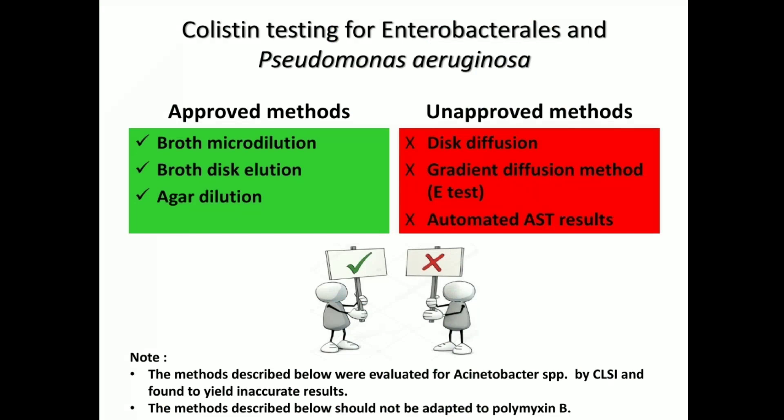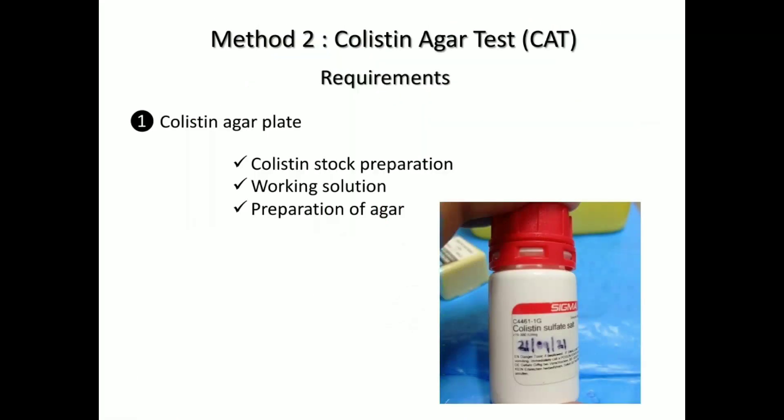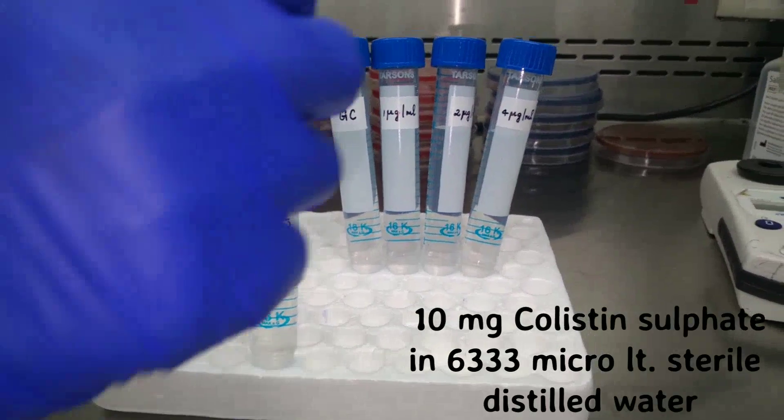The next method we will be discussing is the colistin agar dilution method. The only requirement for this method will be a colistin agar plate, which we will be preparing by using a colistin stock preparation and a working solution. The first thing we will be looking at is the preparation of the colistin stock, which can be prepared and stored after preparation at minus 80 degrees Celsius.